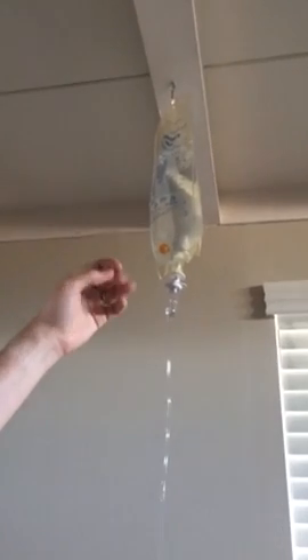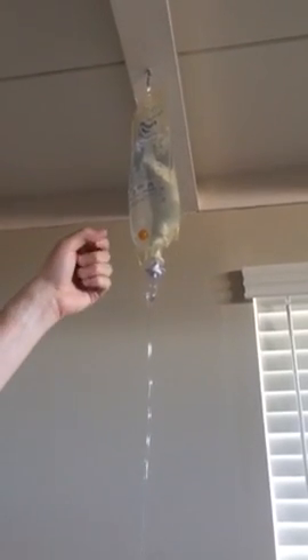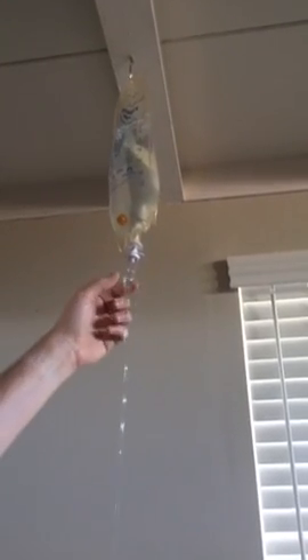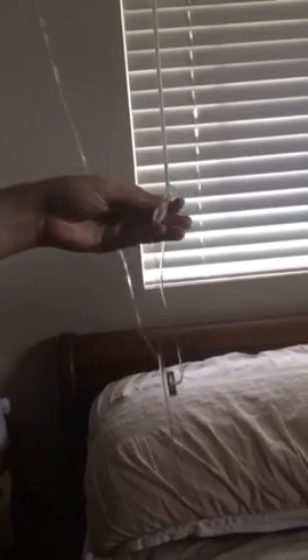You can see the water is flowing out pretty quickly, which is good. Sometimes it will go really slow or not at all — usually if you just flick it or jimmy it, it'll go. We're at two now, so I'm going to grab this, slide it down all the way, and pinch it. Up here you can see it's not flowing anymore.